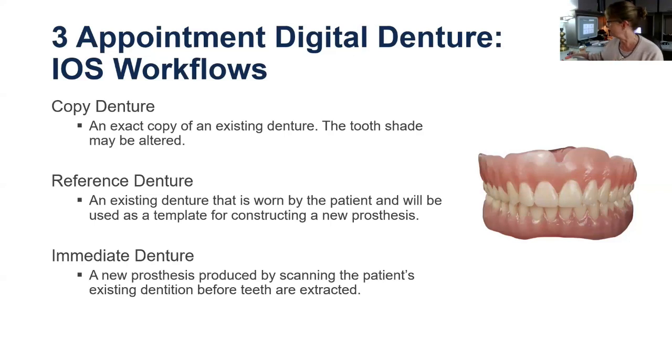And I'm big on show and tell, right? So this is a denture, just a regular old denture. Let's say the patient walks into your practice and says, "Doctor, I absolutely love this denture. I'm going to be cruising this winter or visiting family in Florida over the winter, and I would like a backup. I would like a spare denture, an exact copy of what I have here."